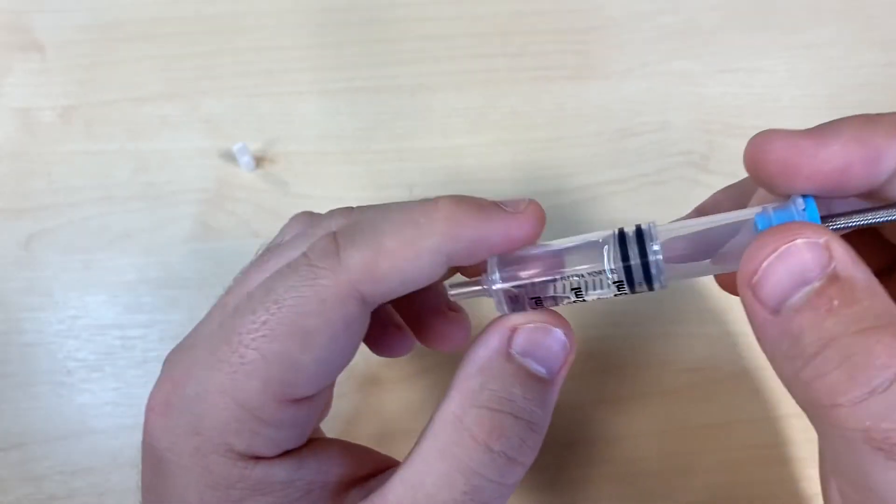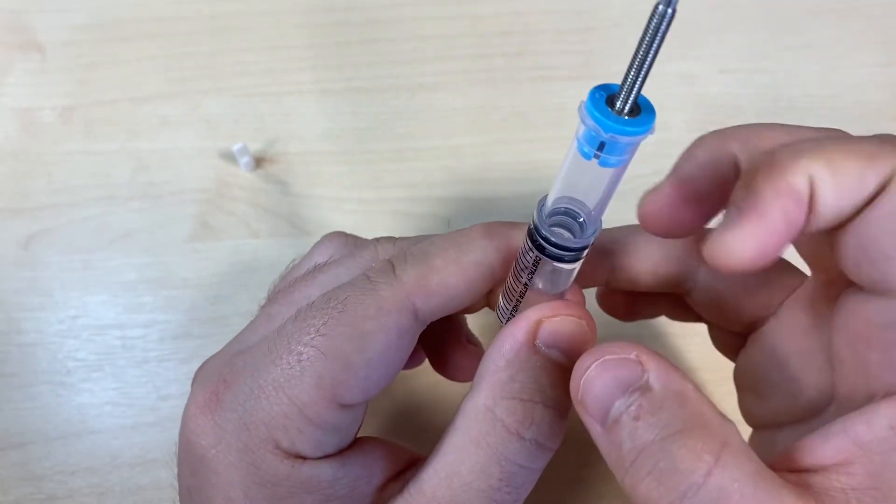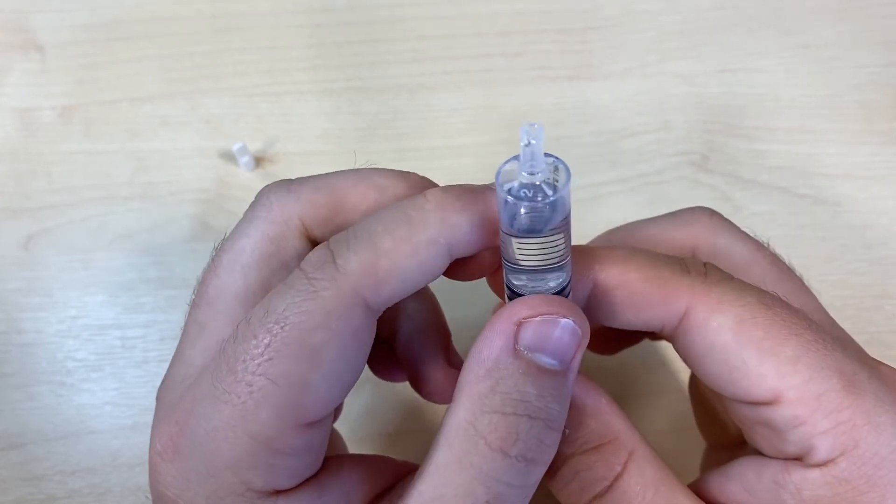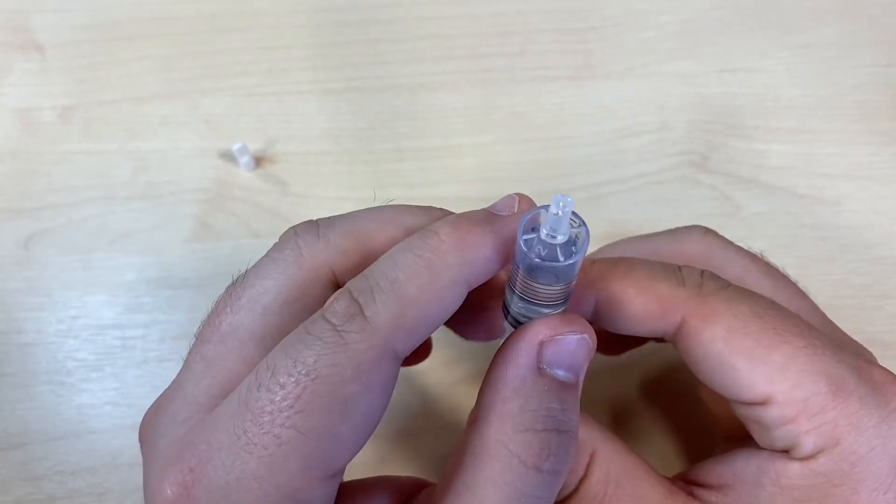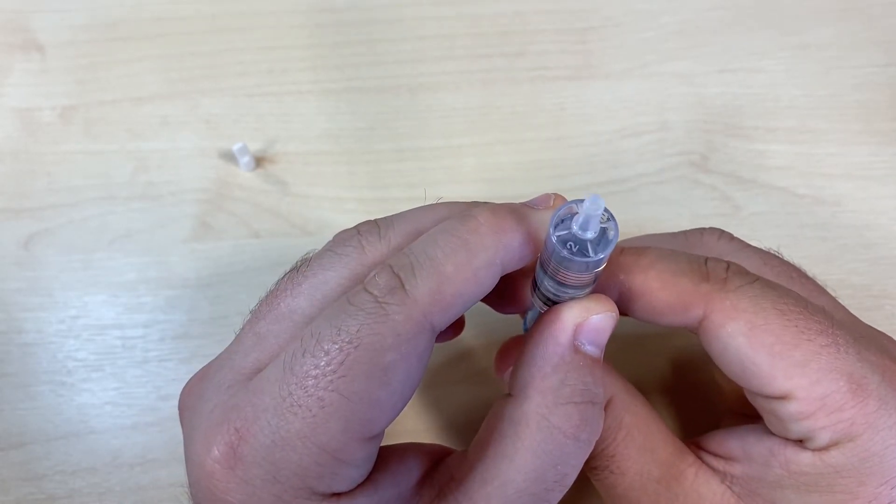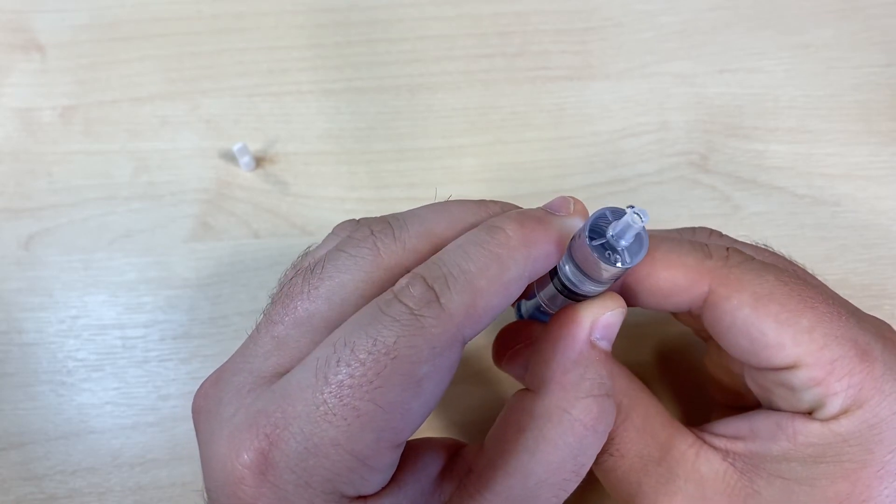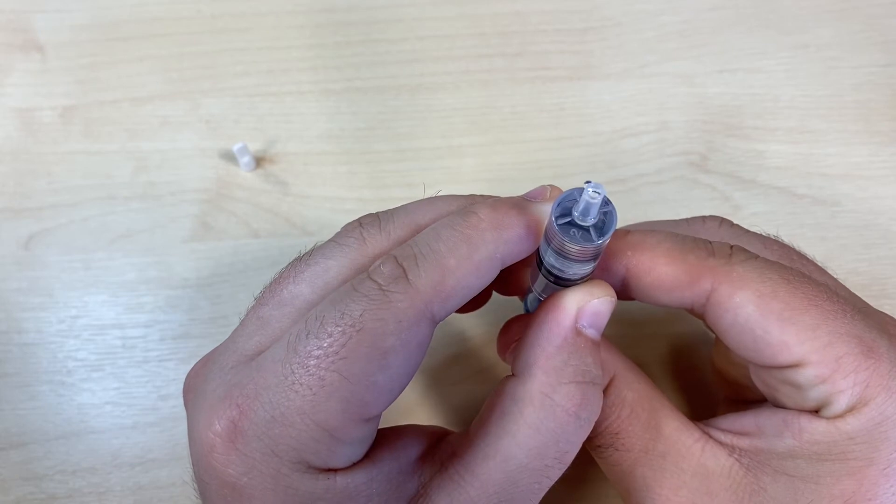If there's any stubborn bubbles, you can always give them a tap. Once you've collected all your air up at the top of the syringe, holding it as vertically as you can, push all the air out until you only have insulin filling the neck.